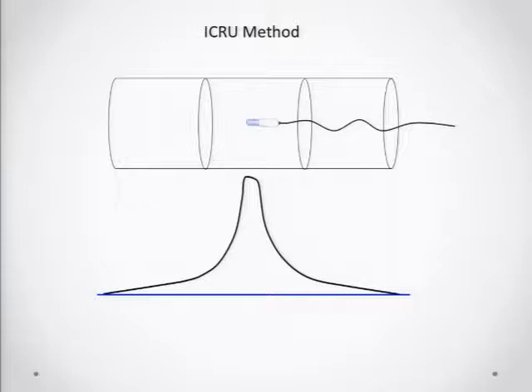You can see that as the X-ray beam is towards the end of the phantom, you're just measuring scatter. As it gets closer to the probe, you're measuring more intense scatter, and then you go through the primary plus scatter, and then it goes off to the other side. You can see it's not symmetrical, and you know the reason why. It's the Heel effect. And CT scanners all demonstrate a real Heel effect through the slice thickness, more important for thicker slices, for thicker collimated beam widths.